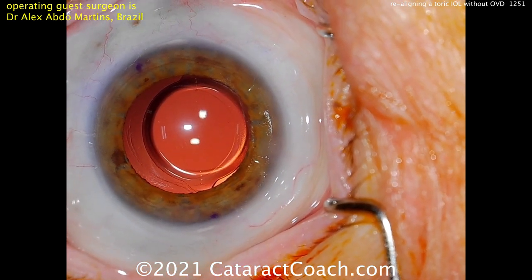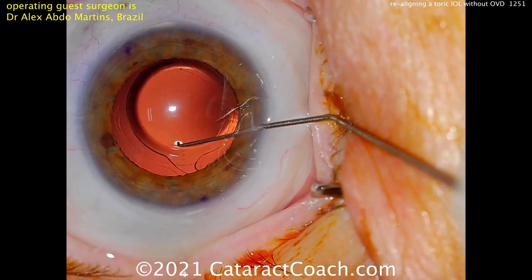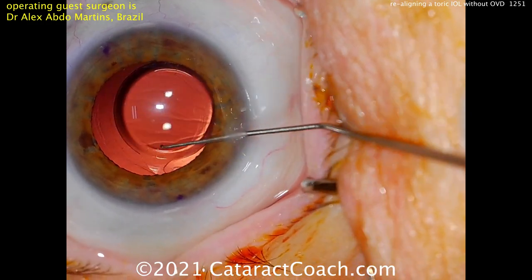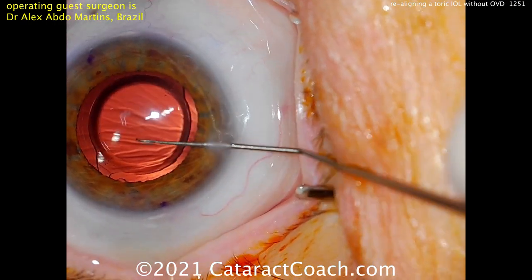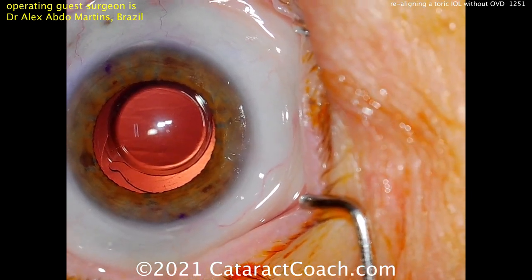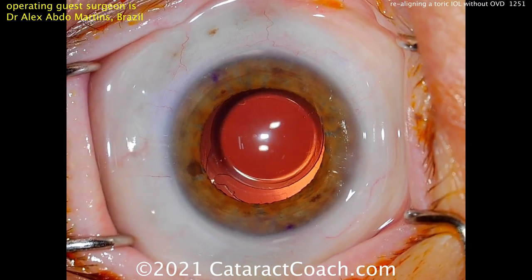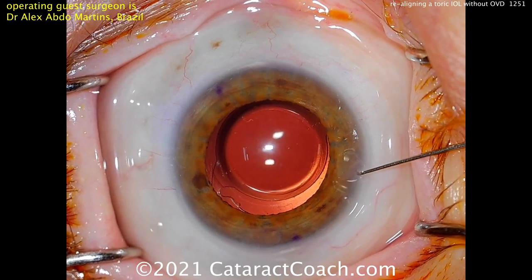The patient is only a week or 10 days out of surgery — this is an easy time to re-rotate a lens. By using the calculators at AstigmatismFix.com, you can determine the appropriate axis to rotate to, and that should make a world of difference. There's an additional maneuver of going back inside the eye, but it's going to be worth it. He's doing a really nice job — take your time, put in more BSS if you need to, get that AC inflated. I agree with avoiding viscoelastic entirely — you'll be better off.